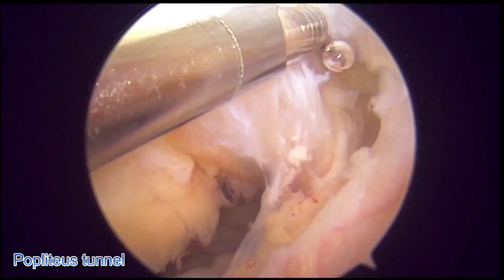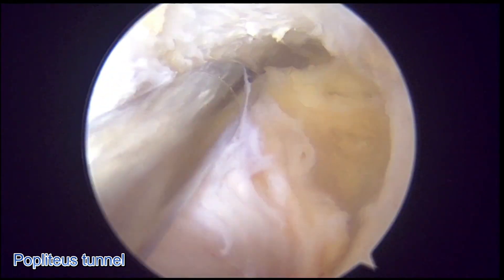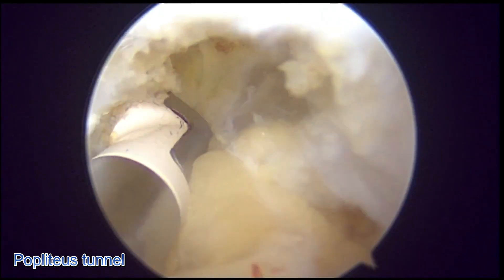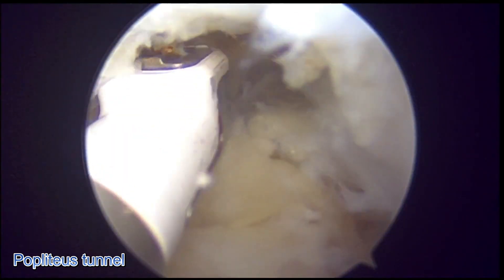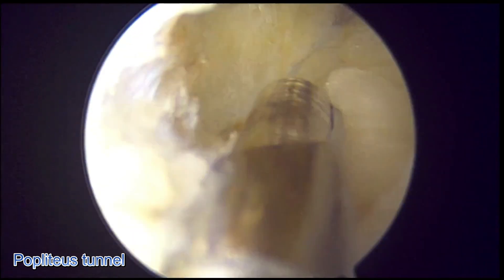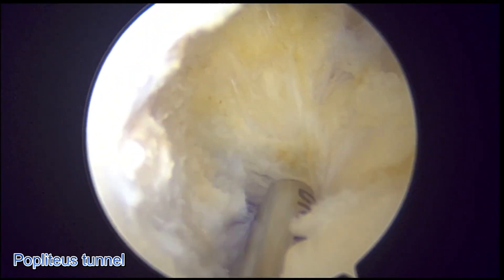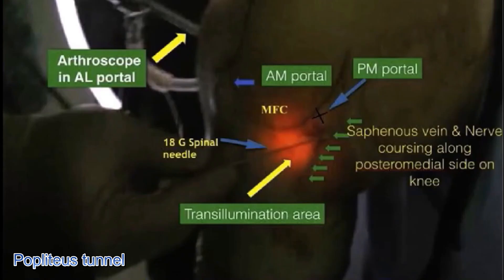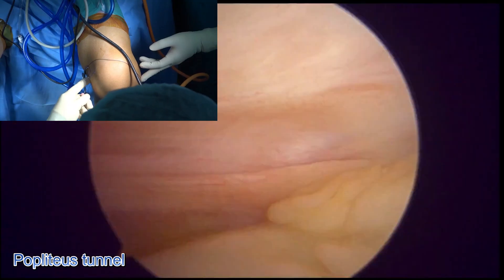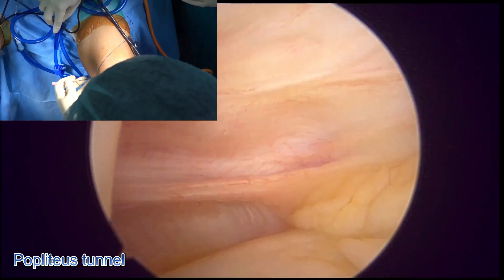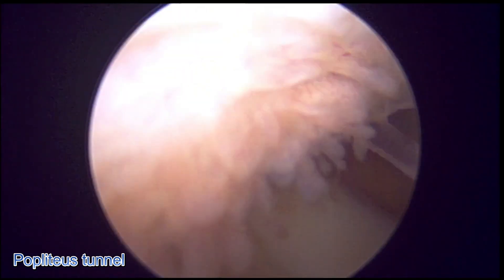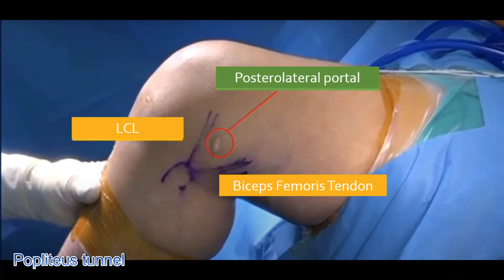We will now gain entry into the posterior compartment using the transseptal technique. A shaver is used to approach the 12 o'clock position in between the cruciate ligaments. Two windows are created in the 7 to 8 o'clock position and the 4 to 5 o'clock position. Using transillumination technique to avoid the saphenous vein and nerve, the posteromedial portal is created. A switching rod is passed from the posteromedial portal to the soft spot between the LCL and the biceps femoris, creating the posterolateral portal.